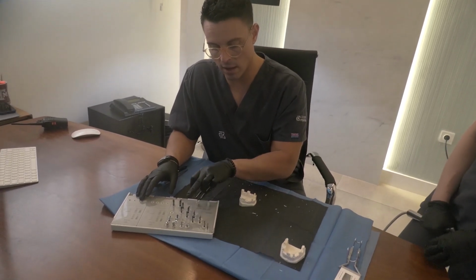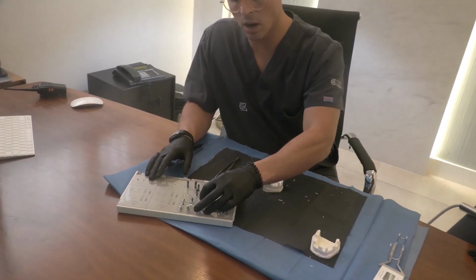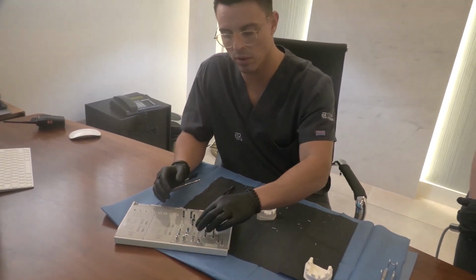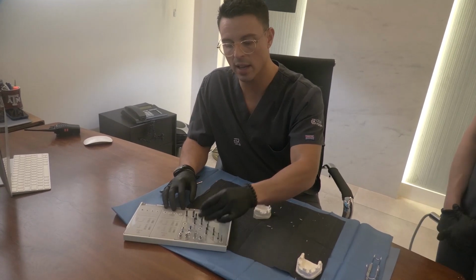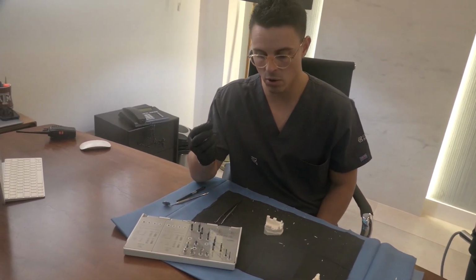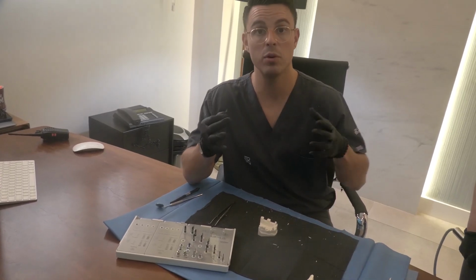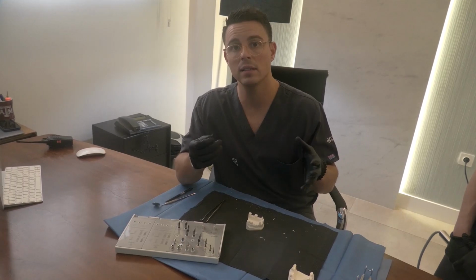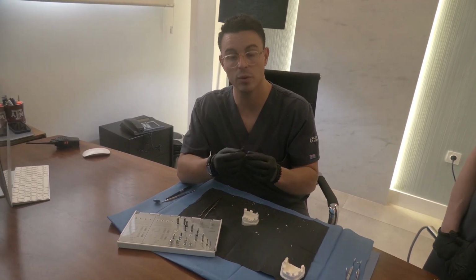In hard bone, type 1 bone, we can say with a very thick cortical layer, this drill will be recommended in order to drill up to 3.5 millimeters in diameter, and so minimize the friction and the trauma during implant placement.